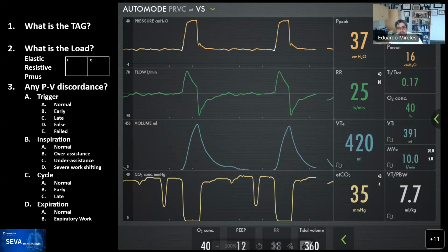And I usually give you a minute here. Nothing is paused. We're just waiting to see what comes out on the chat. Have no fear. The chat is not visible to the recording, and it's just us trying to learn here what you see. All righty. As you are typing in and pondering on this, we'll start on it. So, Rob, do you want to give it a trial? Okay, I see some entries coming in.